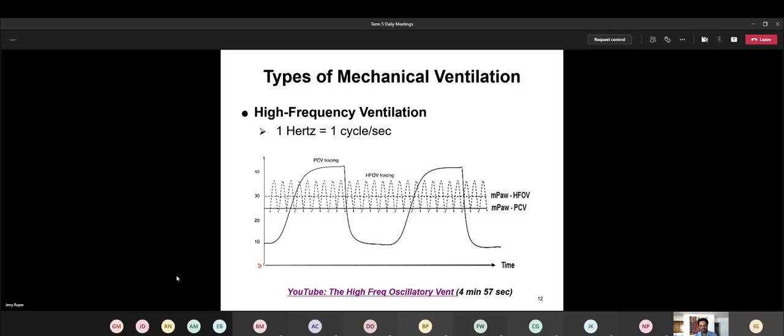And the peak pressure, maybe it's a little bit more because this is 40 and that's the peak right here. So it's a little bit more than 40. But I'm just going to roughly estimate the PIP to be about 40. So if the PIP is about 40, the delta P is 30. We set the delta P to be 30.